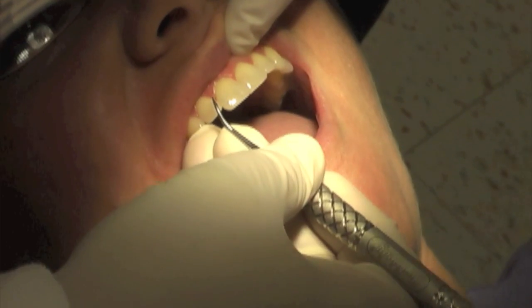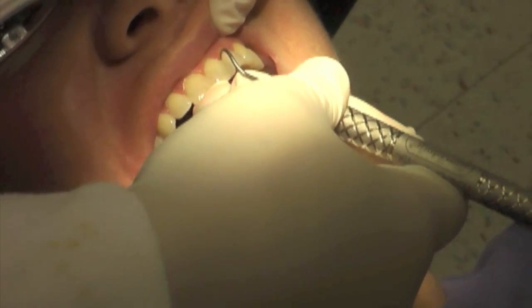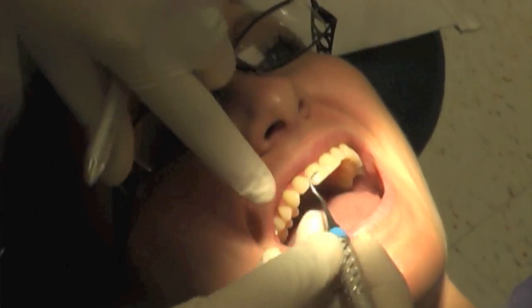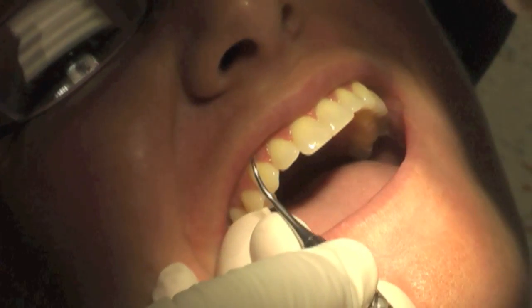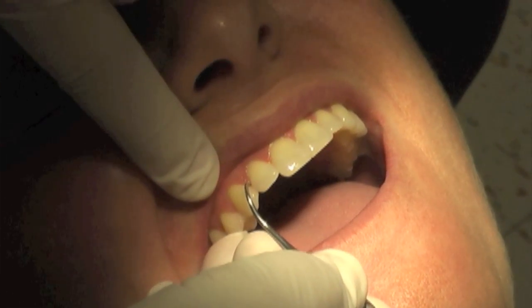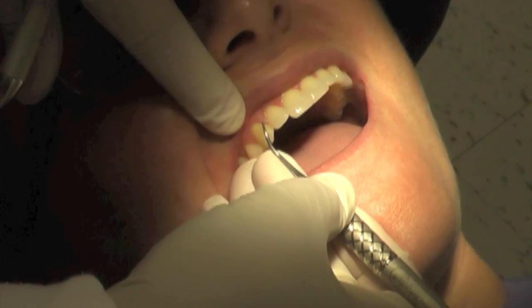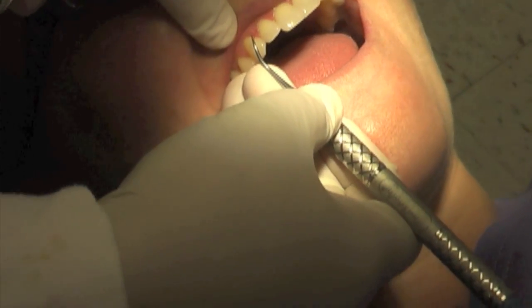That's going to be the only thing that will dig into deposit and remove it effectively. In fact, if we're careful, we can even hear — even though Marcy doesn't have anything — you can hear my blade kind of digging. So when I go in to see if there's a piece of deposit, I go in with such a light stroke that you could take the instrument out of my hand. You can go in leading with the toe and just feel for something. Once you get a piece of deposit identified, go ahead and apply. See now you can see my grip become stronger and I apply lateral pressure and then actually go in for a working stroke. So there's a difference — see the difference in my hand versus this.